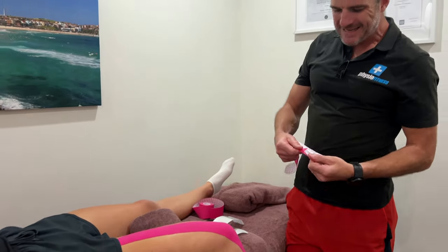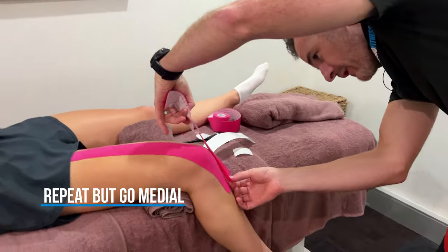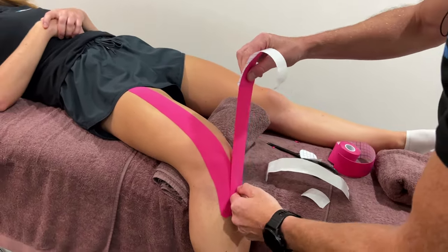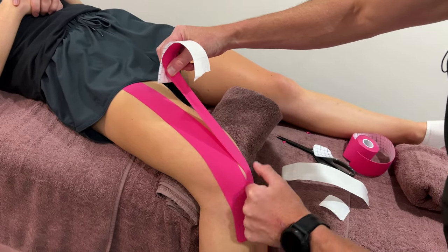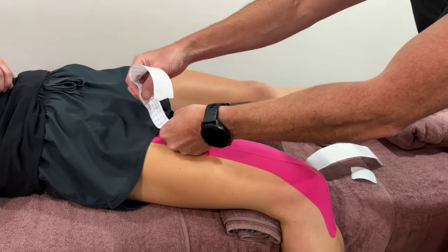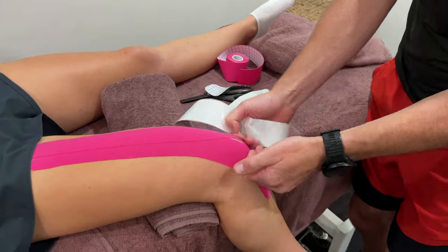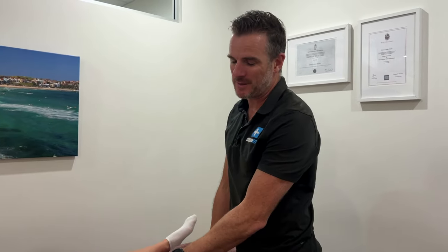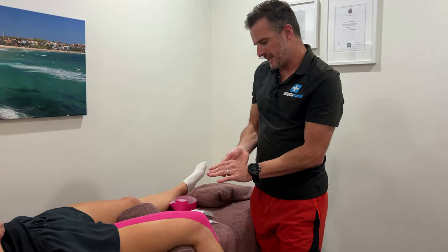Then your second strip goes over top of that by half, because you're covering the middle again. Now it's easy — you just go half of that. That means you've got a double layer in the mid-line and a single layer on the lateral and medial sides. Same technique: once you've got the anchor on at zero, pull it to about 50% around that kneecap, come back in line so you're covering half the tape again, then pull it up at 75%. Hopefully if you've done it right, you're pretty much at the same height at the top. What this does is cover around the kneecap, which gives a bit of support. You need that for both patella and quadriceps taping, because you're trying to engage the whole quadriceps length from muscle to insertion down in the tibia.